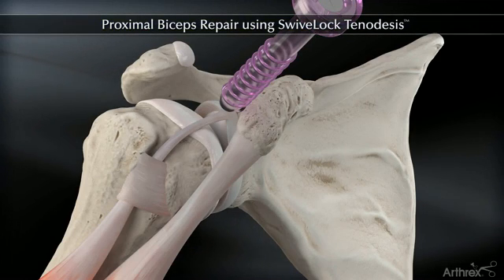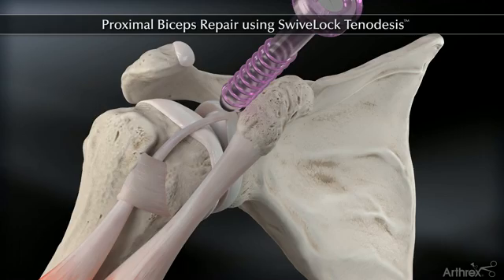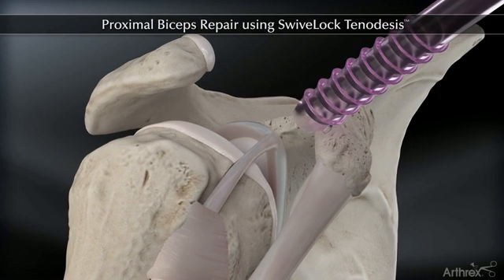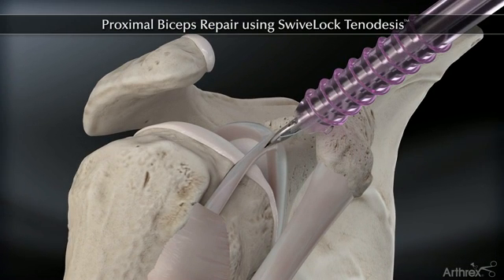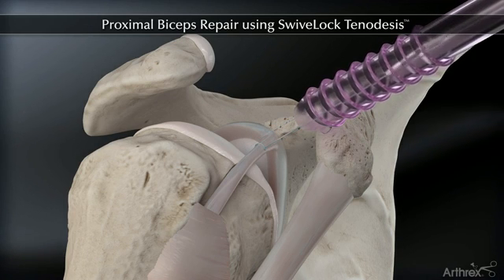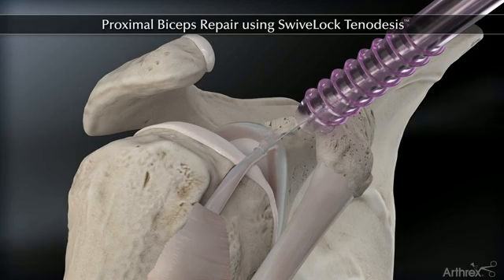The Swivelock tenodesis system enables all-arthroscopic biceps tenodesis without externalizing or whip stitching the tendon. While viewing intra-articularly, place a tag stitch through the biceps tendon and resect the tendon at its insertion.